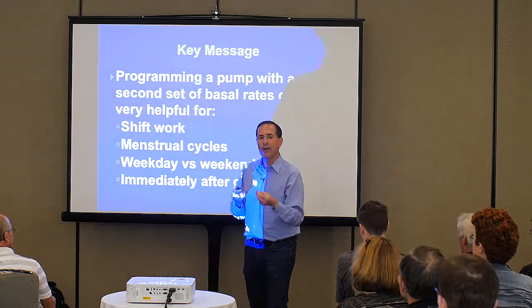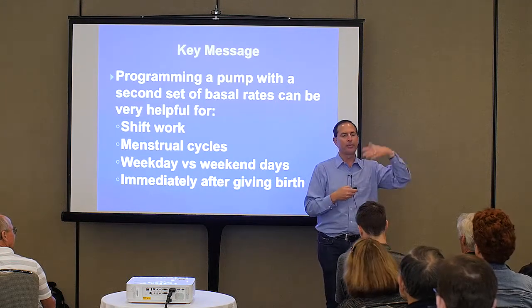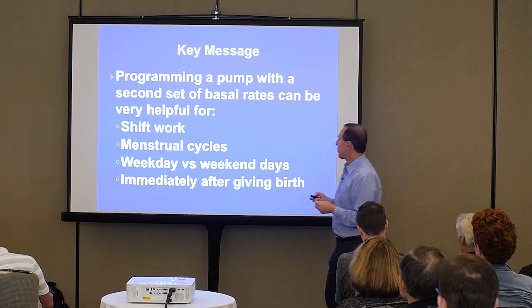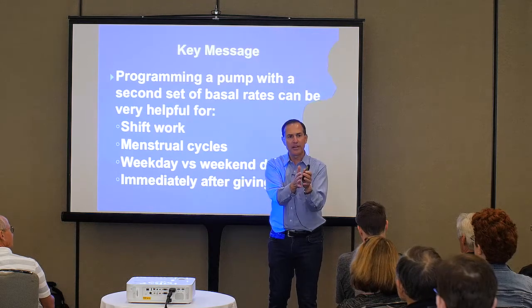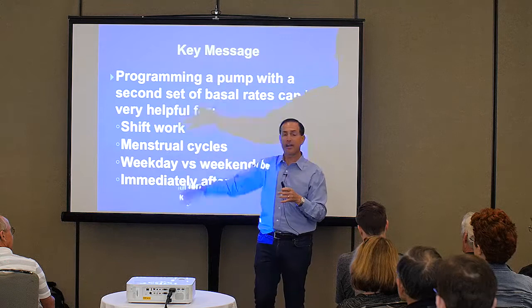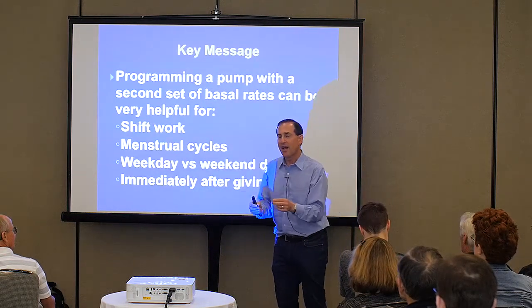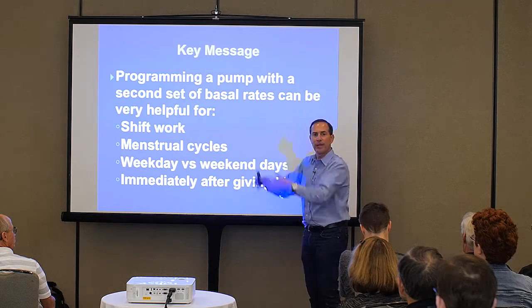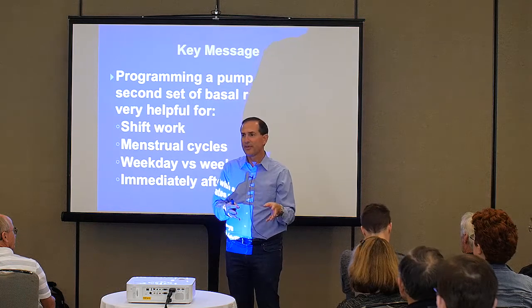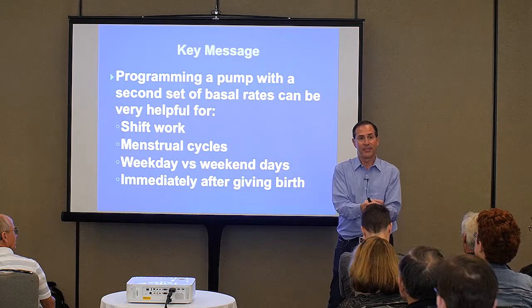So what I do, and it works amazingly well, if any of the young ladies here see pregnancy on the horizon, talk to your doctor about this option: you pre-program. During pregnancy, your basal rate requirements go up and up and up, but they're going to fall off a cliff as soon as you have your baby. So with my patients, I pre-program a whole second set of basal rates, much, much lower than what they're on at that moment. In fact, I pre-program them to what they were on before pregnancy minus a third.